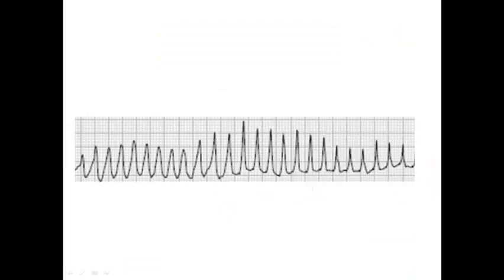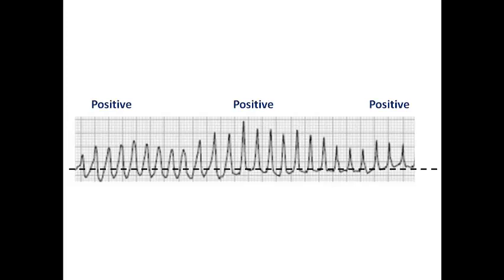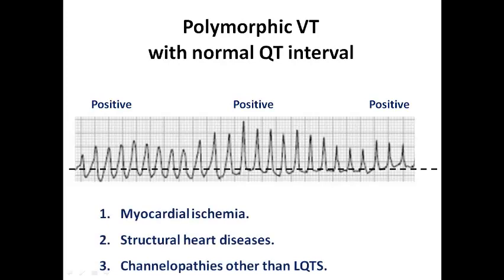In this ECG we can see it is not monomorphic because we have more than one morphology — at least three or four complex morphologies. If we draw an imaginary line to represent the baseline, we can see that all complexes show a positive axis in this ECG strip. So this patient most probably has polymorphic VT with normal QT interval if we check his resting ECG.